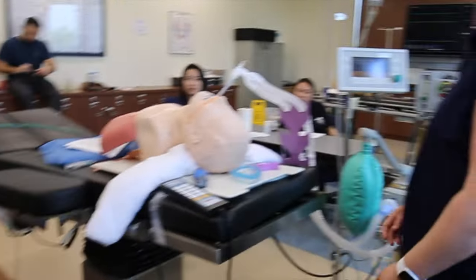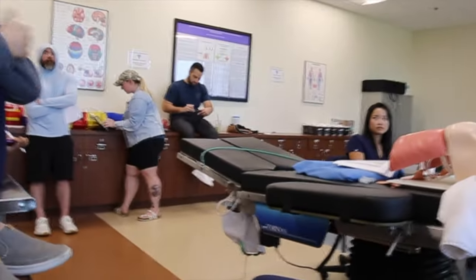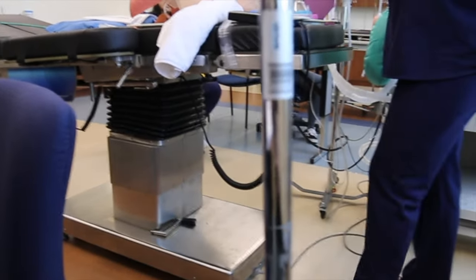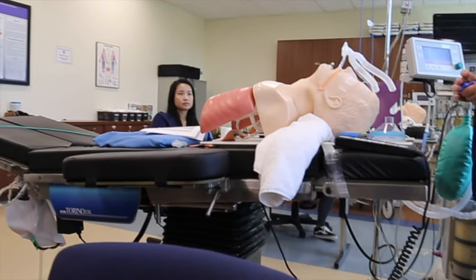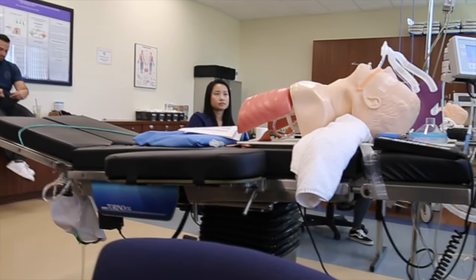How deep do you have to go in the ET tube? Oh, that's a good question, Alex. I am at 21 at the moment. And it changes, depending on the person's airway, absolutely. Generally, 21, 22, sometimes 20, sometimes 23. Outside of 20 to 23, those are on the far ends of the bell curve. You don't see it too often, but you do see it.